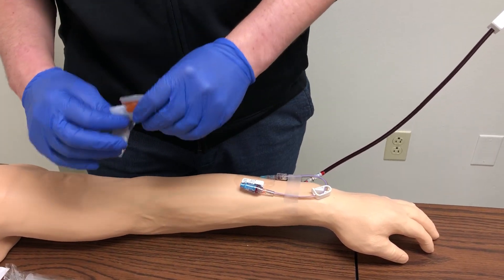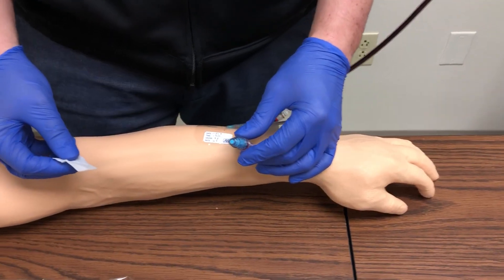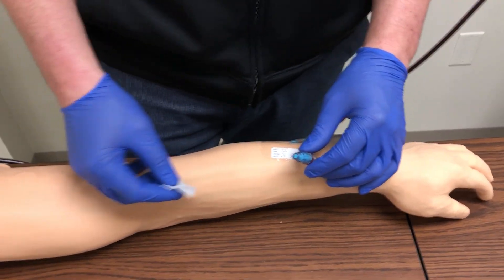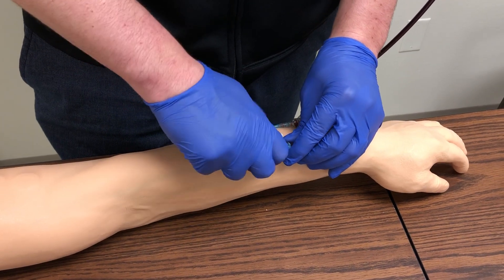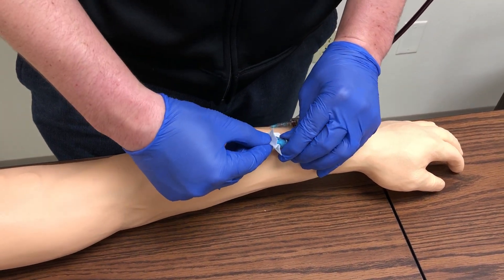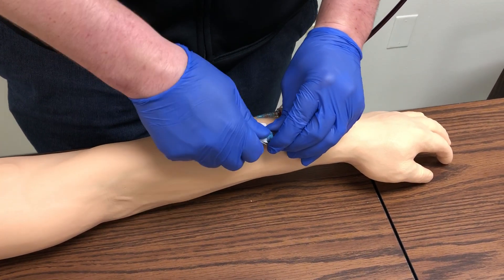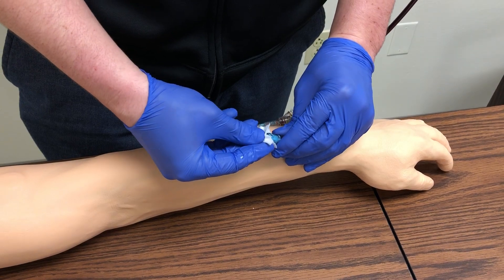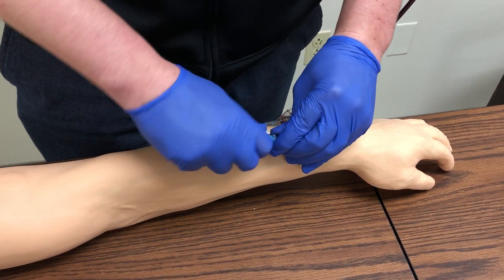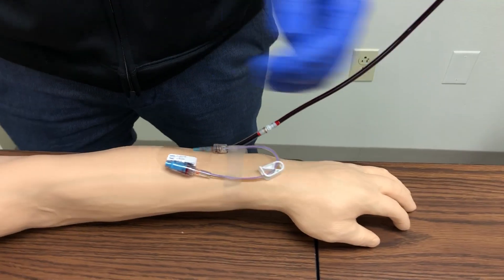The first thing you want to do is swab the injection port for at least 15 seconds. Make sure you're getting around the injection port — you can even push in a little bit. Make sure you're cleaning thoroughly. Then you want to let that air dry.